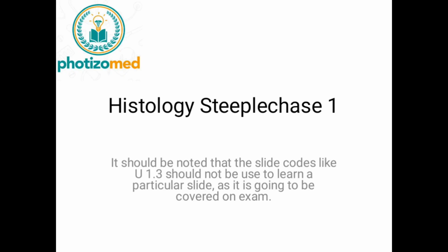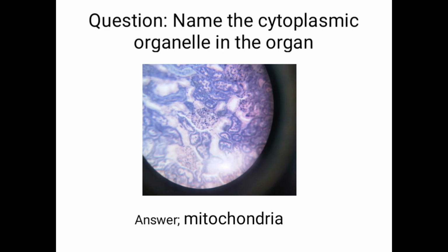We're talking about histology today, and note that the slide codes are not peculiar to each slide. They'll be covered during your exam. So first question here is: name the cytoplasmic organelle in the organ, and that's mitochondria.